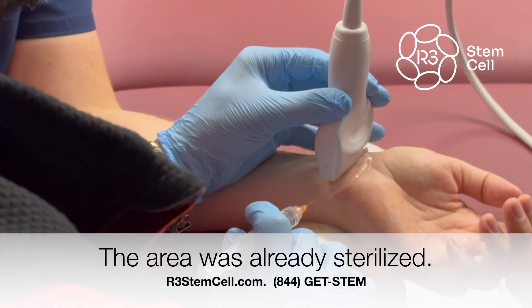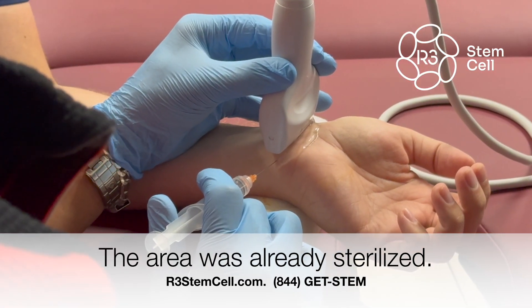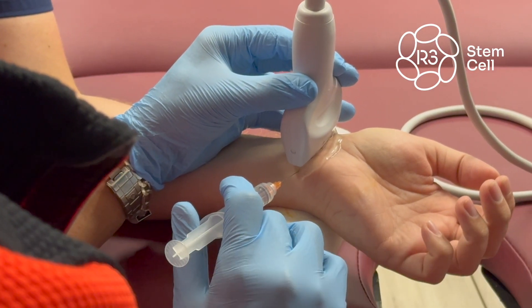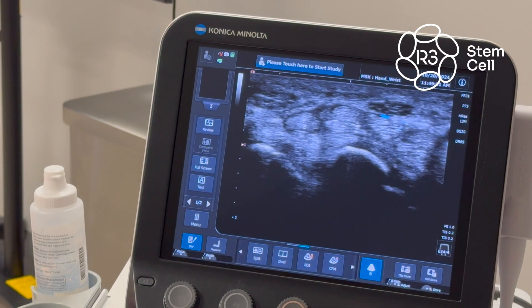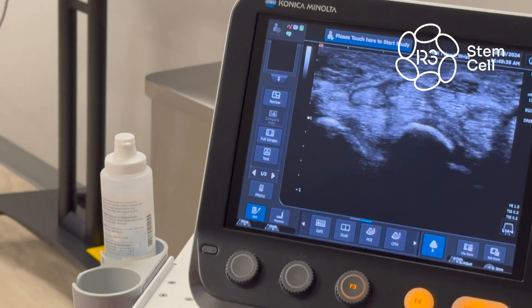We're going to be real superficial here, so go pretty much right underneath the probe. Go ahead and get in. Don't go too far — let's find out where you are. Get all the way under. Right there, perfect. There's the tip of your needle right there. Go ahead and inject about two cc's.